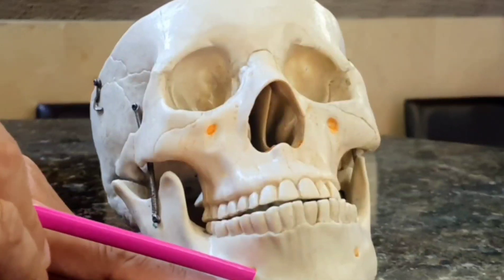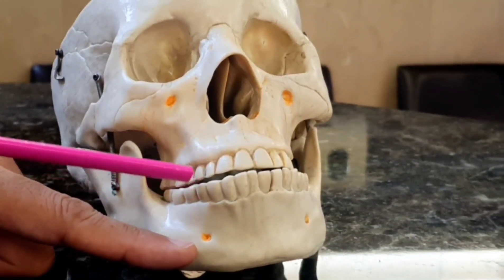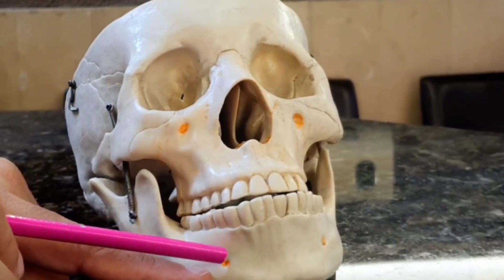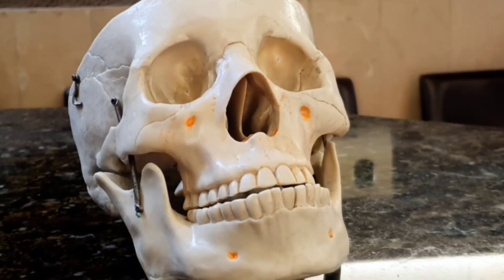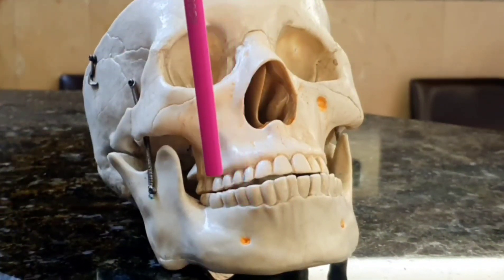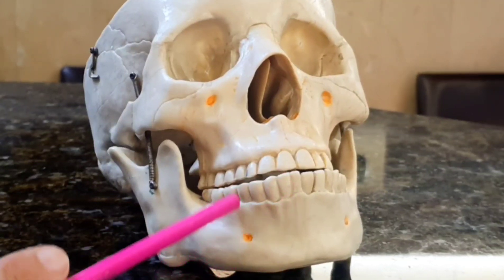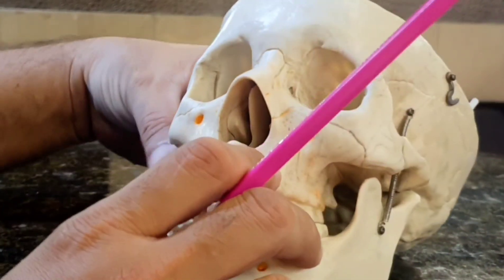When it comes to the mental foramen, you would go in vertically. The mental foramen is normally at the second premolar site, at the apex of the second premolar and maybe two or three millimeters apical to the apex. It could be between the first and second premolar, or between the second premolar and first molar, but the second premolar site is where you're targeting. You can palpate it from outside along the lower border of the mandible. You go vertically into it from the top, sometimes feeling yourself dip into the foramen, and inject local anesthetic there. For about an hour of procedure, all you need is half a carpule — about one cc or one milliliter of lidocaine 2%.